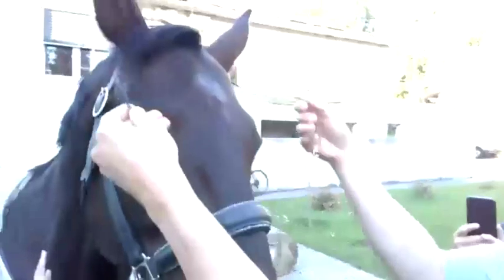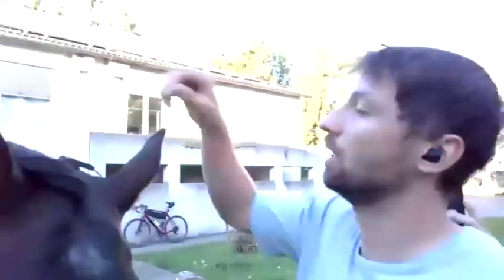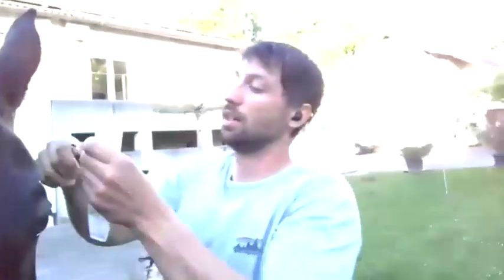You can see here the electrodes. What I'm doing now is removing the hair a bit behind the ear, and I'm starting to gel. On the left side, we have 1 to 4, and on the right side, we have 5 to 8 and the ground.